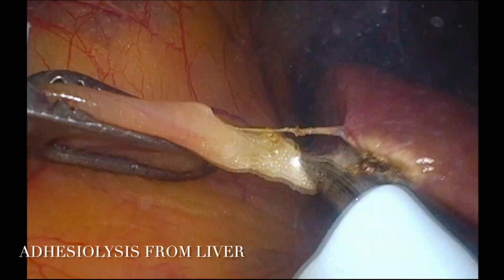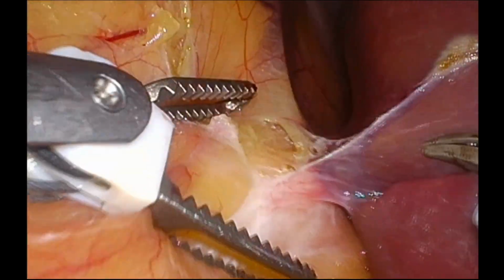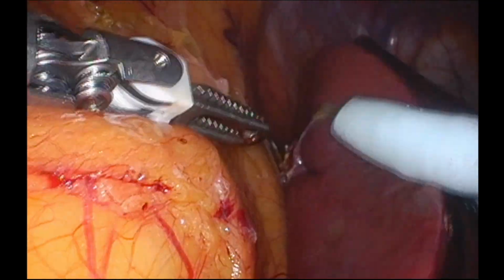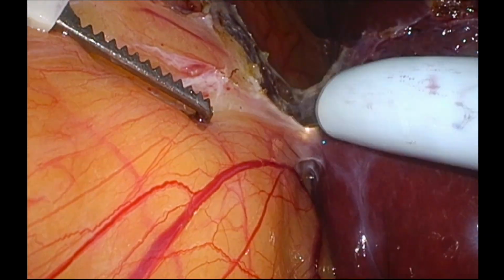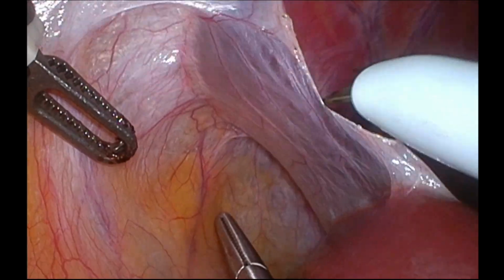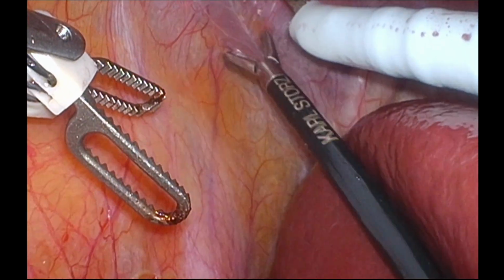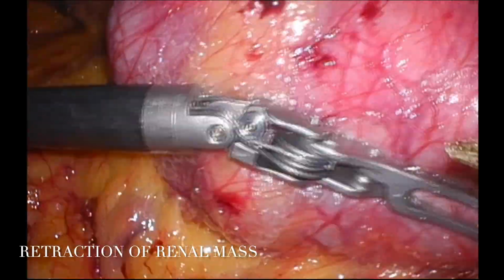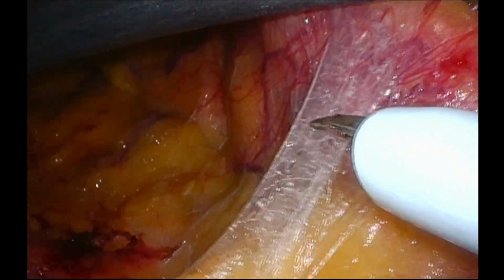Adhesiolysis from the liver is done to free the kidney at its upper pole. Liver is retracted with a tooth grasper through 5 mm assistant port. Judicious retraction of the kidney along with the renal mass is done with third robotic instrument, that is the prograsp.